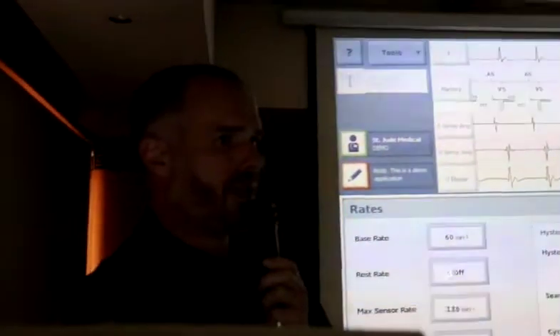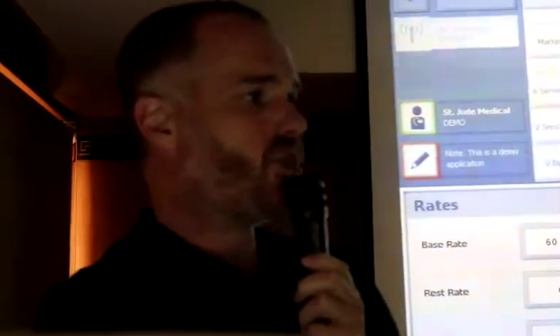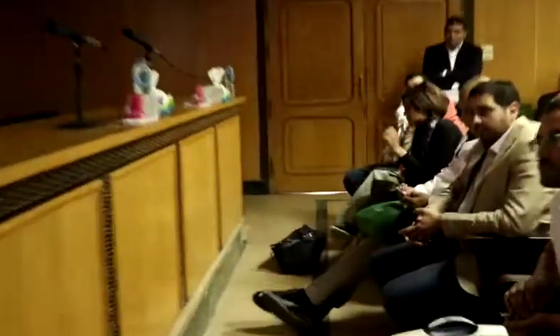Do you want to pace this lady at 60 beats per minute in her atrium at night? She has no SA nodal disease. Do you have a night rate, a rest rate? Yeah, we have rest rate. So what rest rate does, this is nice, right? So we put this on 40. 40 maybe. I would do 40, absolutely.